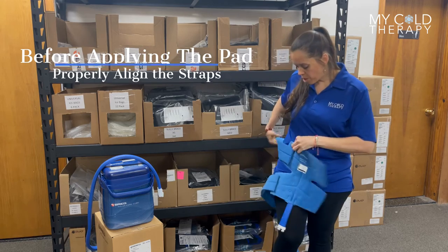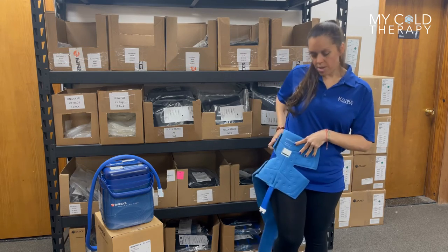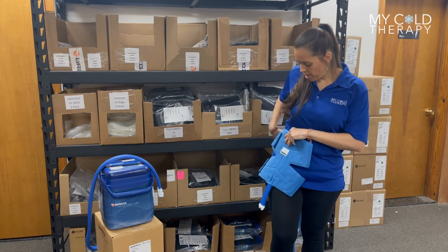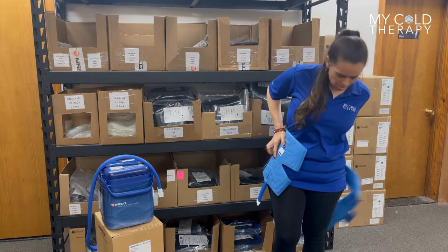You can start with whichever side — it doesn't matter. I can start on my left side; it works the same. But today I'm going to apply it on my right side.